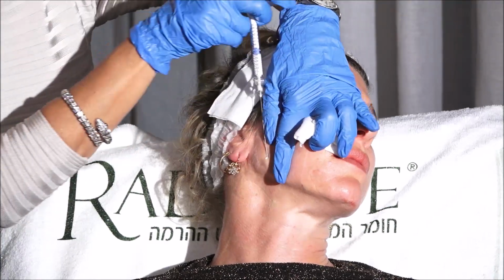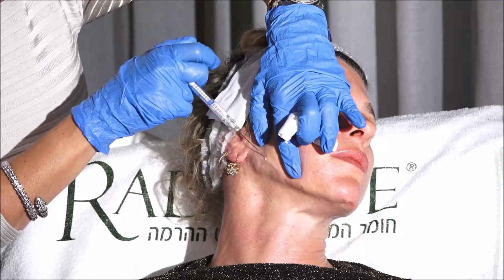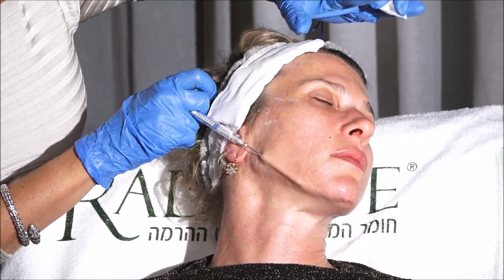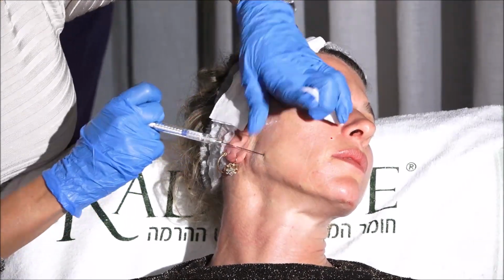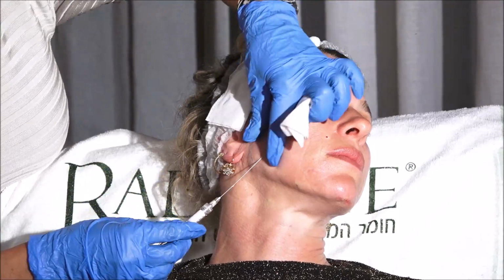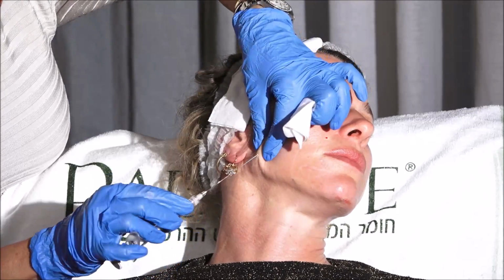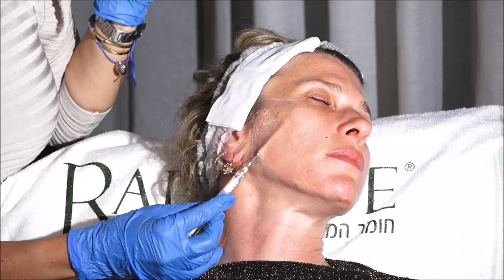And you see that I'm injecting a very low amount. Very superficial. And I'm going to cross up. My goal is to wash the whole lateral face with that. See?